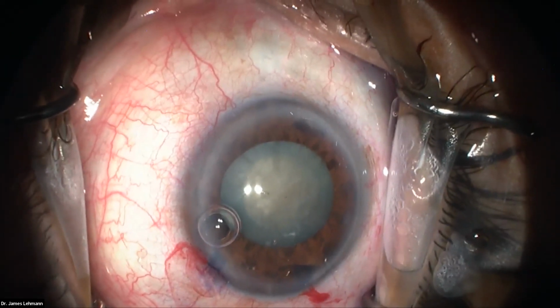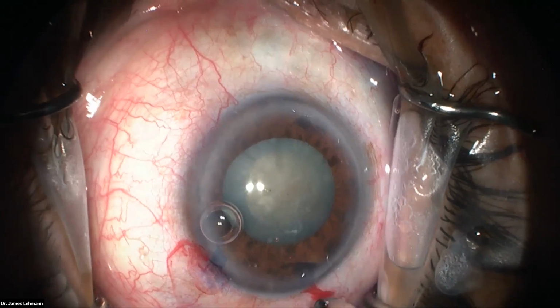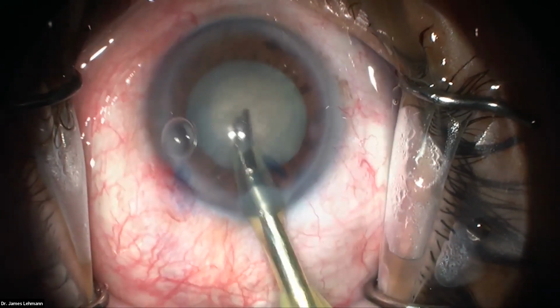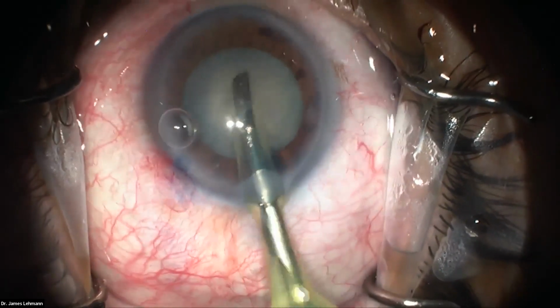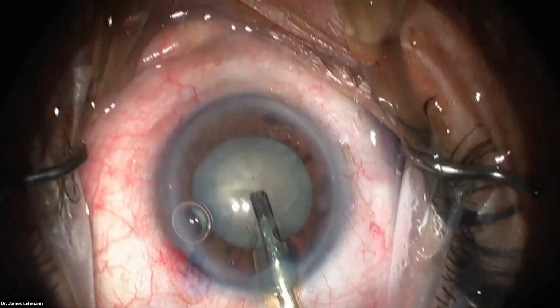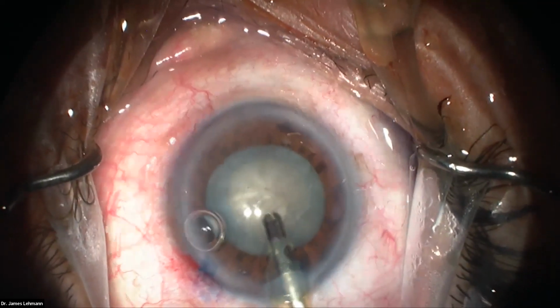Let's put it on dense setting, Sylvia. I have two settings on my phaco machine. One is standard and one is dense. Yeah. And then I'll center the camera here, guys, in a sec. Y'all let me know if it's centered nicely. And then we have a great view.